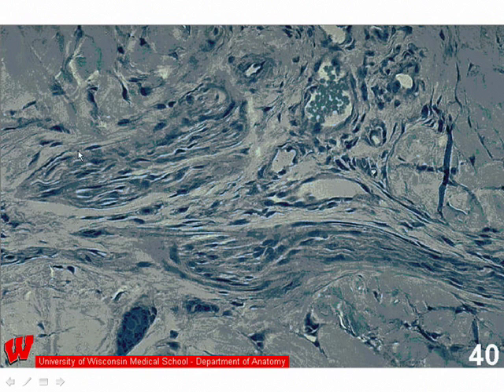Up here, we see a similar longitudinal section of another peripheral nerve bundle, again by comparison with blood vessels, by comparison with the surrounding connective tissue, by its lack of anything that distinguishes it as muscle. This structure can be determined to be a peripheral nerve bundle.